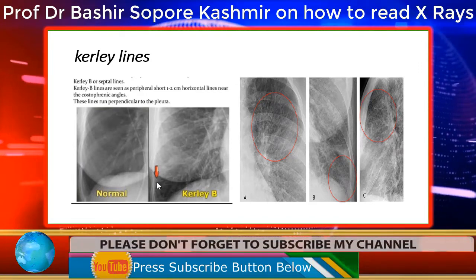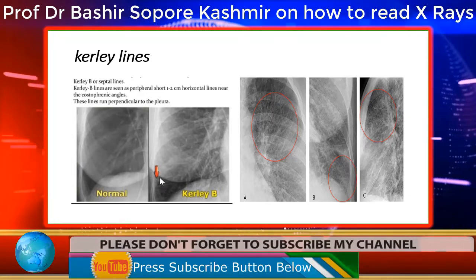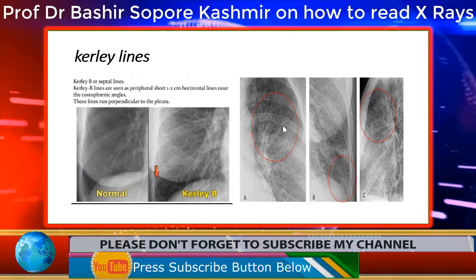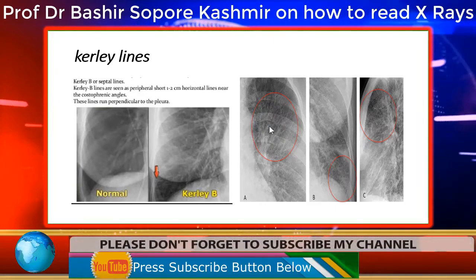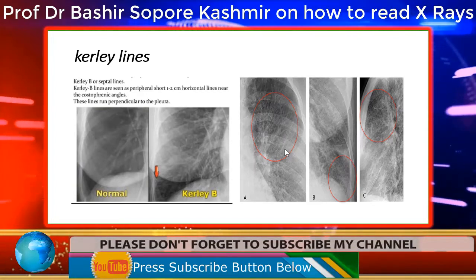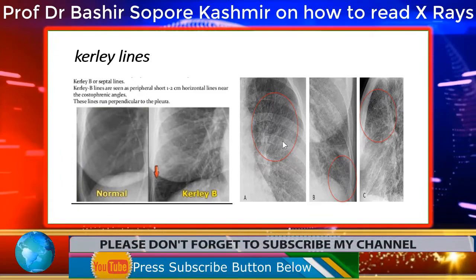But again, if you see here, this is a horizontal line, this is a horizontal line. So these are called Kerley B lines. And you can appreciate here the lines going obliquely up, linear opacities running obliquely upwards. So you can call them Kerley A lines.